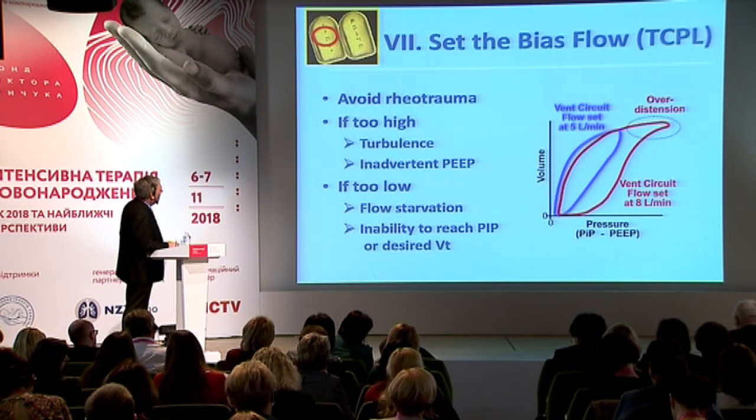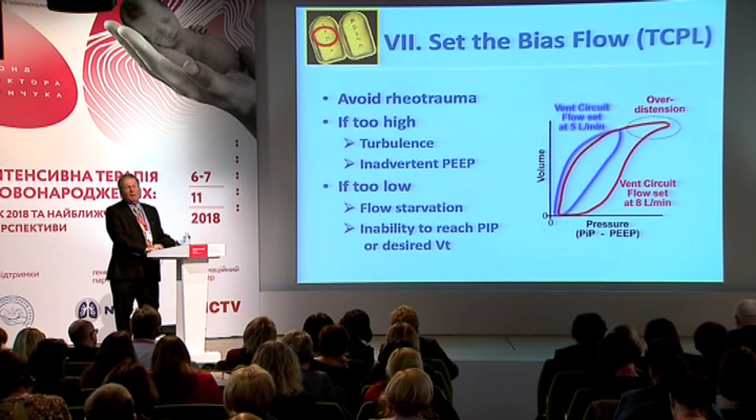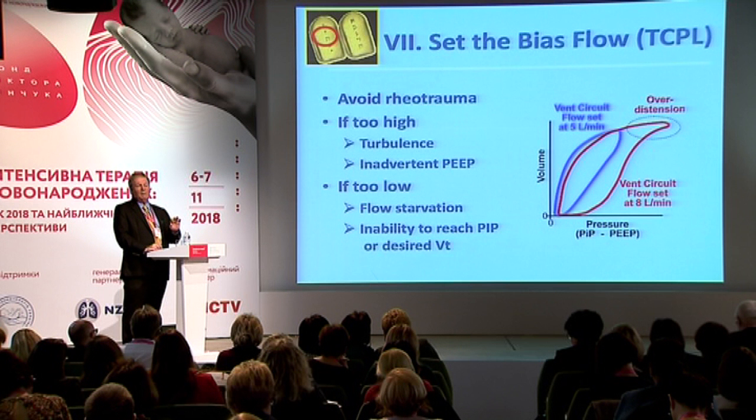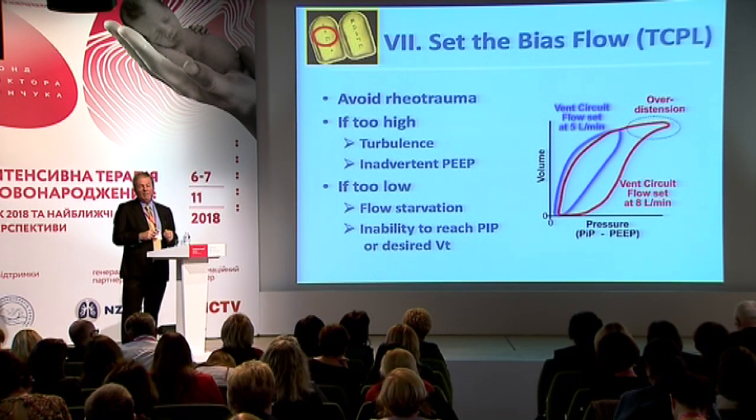Okay? And I think the way to remember this is the definition of flow. Flow is the time rate of volume delivery. So by decreasing the flow, you're also going to decrease the volume.